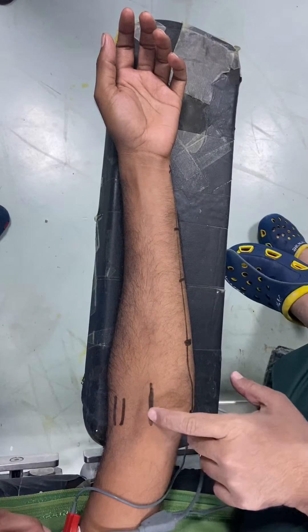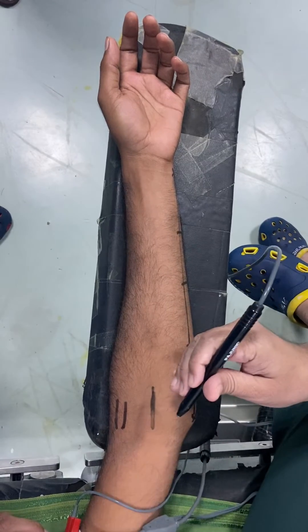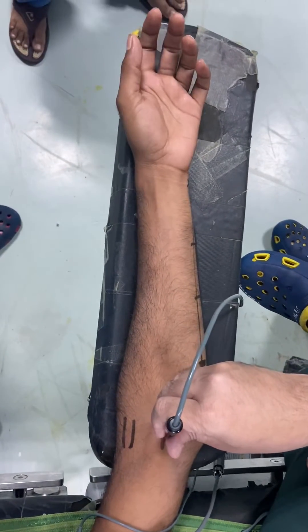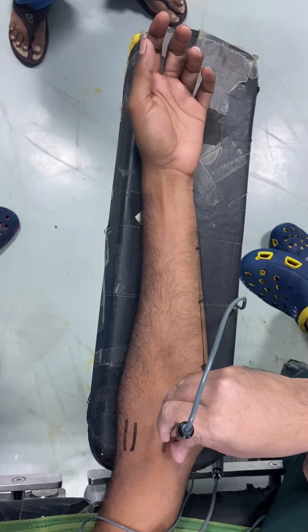First is the median nerve. This is the brachial artery. I'll go medial to it and look for the response. I've set the current to 5 initially. I'll put the needle and here you can see the response — it is very nicely seen.